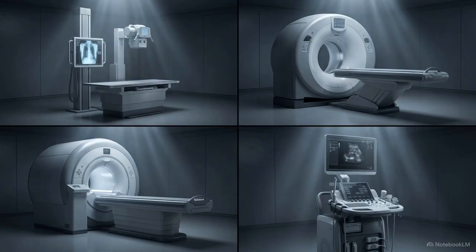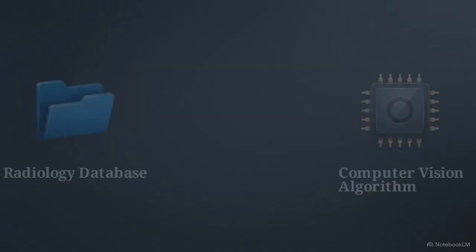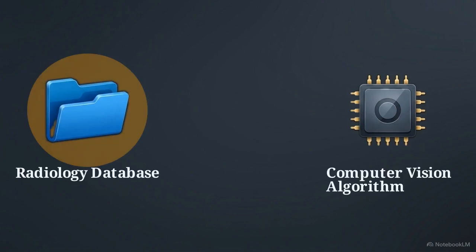Hospitals generate massive amounts of visual data through medical imaging, the field that creates X-rays, CT scans, MRIs, and ultrasounds. The medical specialty highly trained to read these images is radiology. Because radiology produces so many images, it provides the perfect training ground for computer vision. This is a branch of machine learning where a computer learns to interpret pictures.